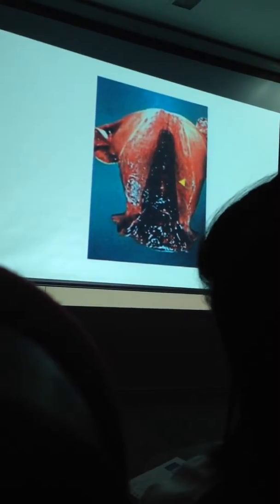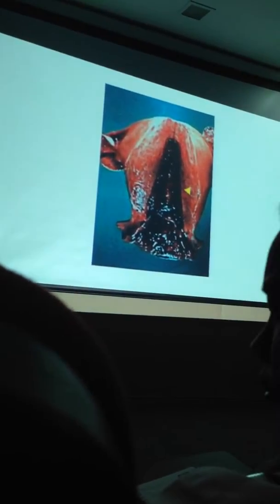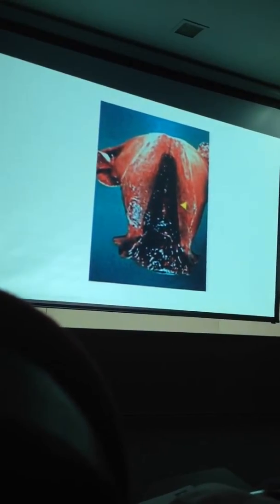Okay, this is a case of a gravid uterus. This patient went after delivering, the bleeding did not stop. No, she had uterine atony, and then she kept on bleeding. Of course, you don't want her to go into hypovolemic shock. Okay, so they opt to remove the uterus. Okay, because it did not contract.